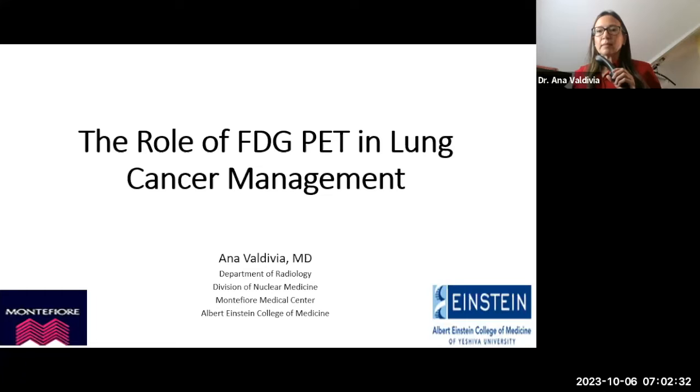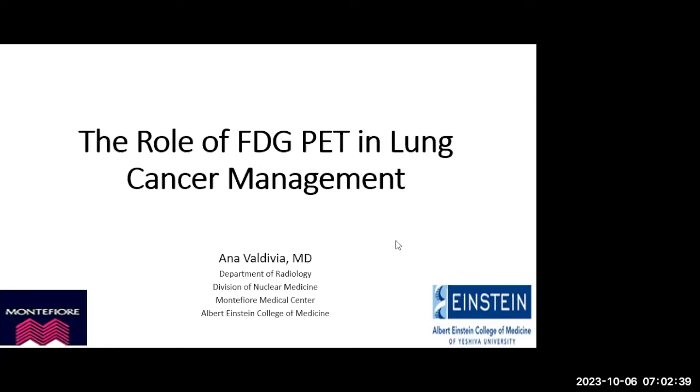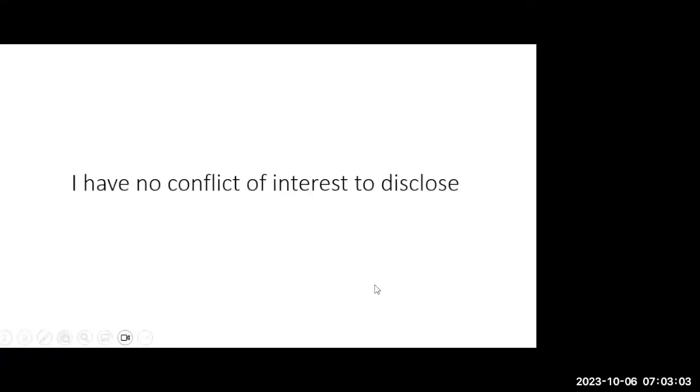So, as said in the introduction, I'm going to be talking about the role of FDG PET in lung cancer management. FDG stands for fluorodeoxyglucose. And first, I want to start with some basics, of course, which are important to be familiar with before moving on to the deeper part of this talk. I have no conflict of interest to disclose.